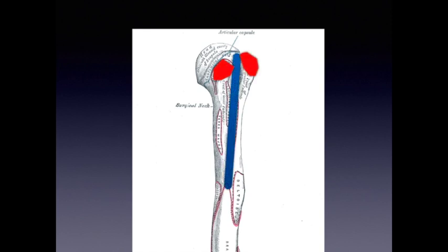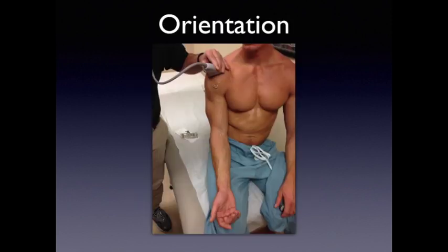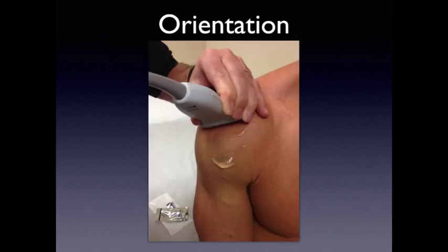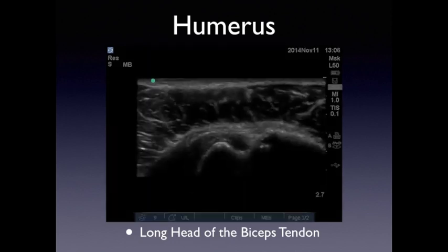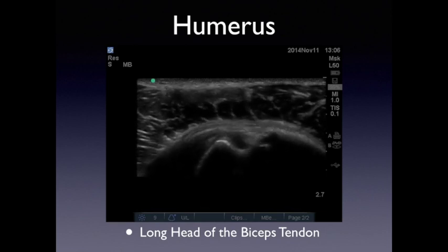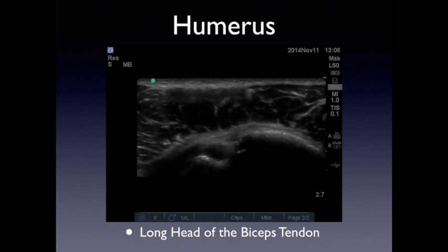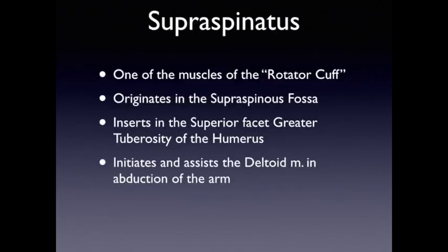As we look at the bone, we'll see a close-up of the tubercles of the humerus and the groove where that tendon should be visualized. We'll use a linear transducer, and it's very important to keep your patient in the correct anatomical position with the forearm supinated. We'll do a transverse view near the deltoid — you should see the tubercles of the humerus and the tendon beneath. Now we're seeing a dynamic image of the patient doing internal and external rotation of the arm.